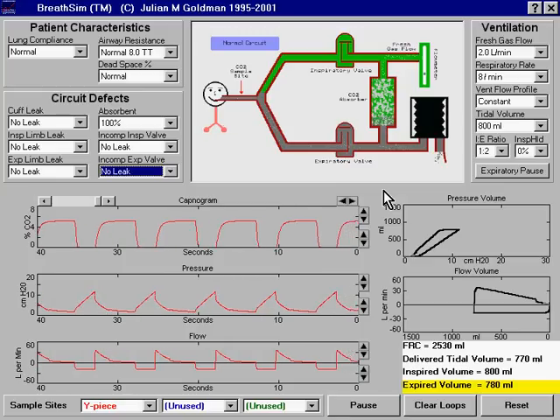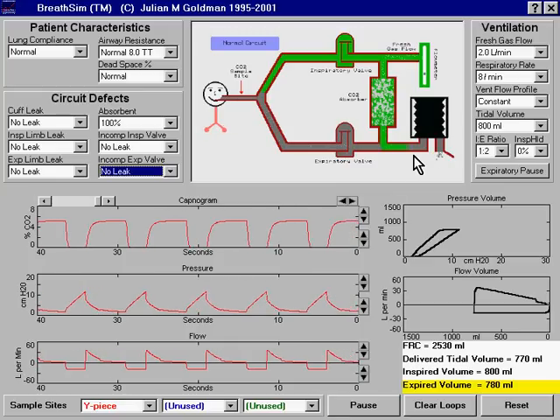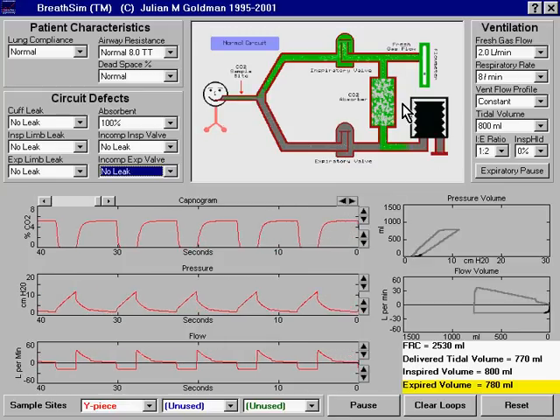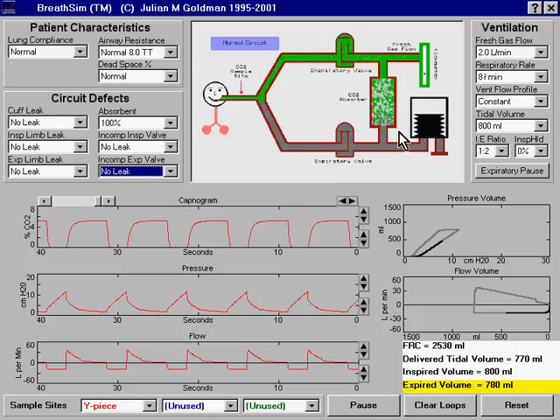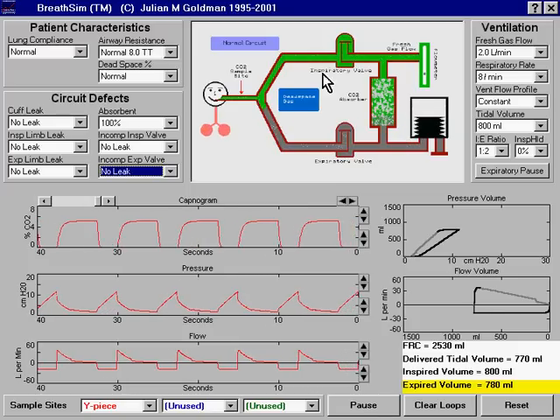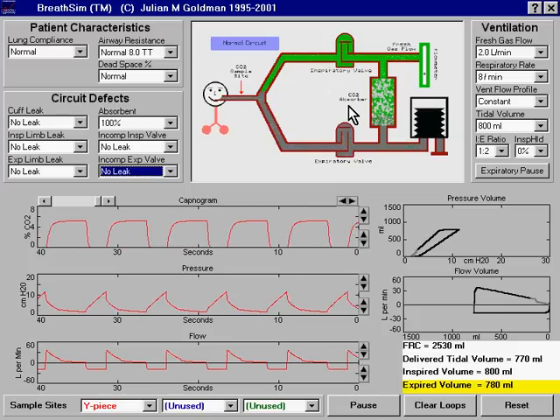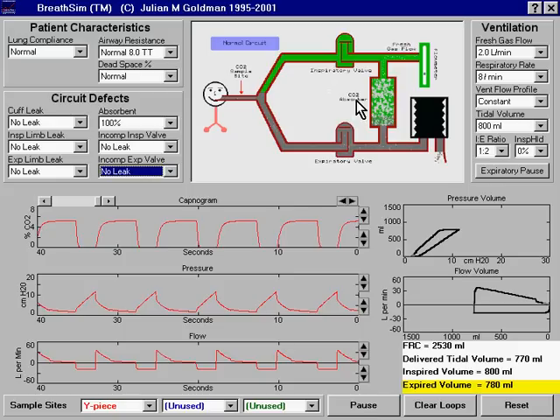Normally during inspiration, the ventilator bellows descends and pushes the gas through the CO2 absorber and into the inspiratory limb. The CO2 absorber removes CO2 from the previously exhaled gas.